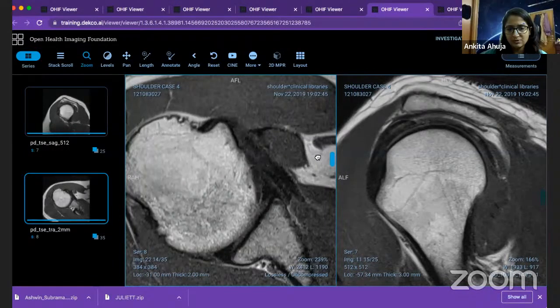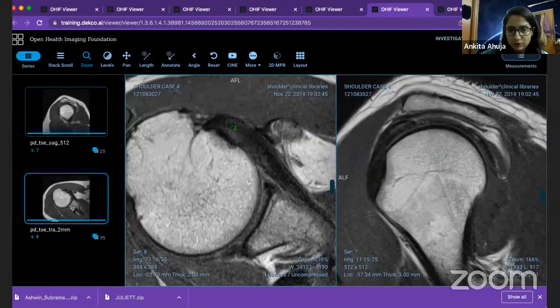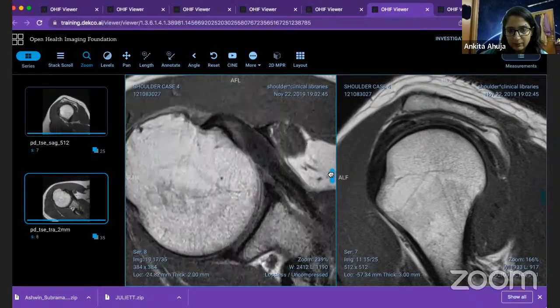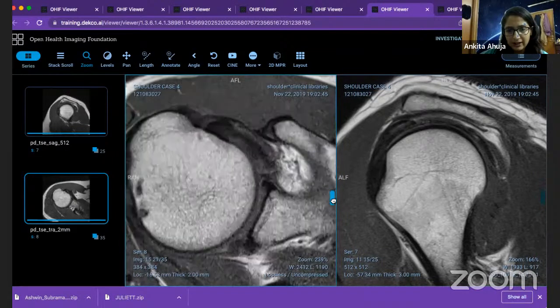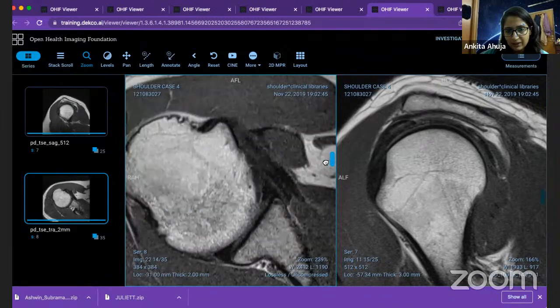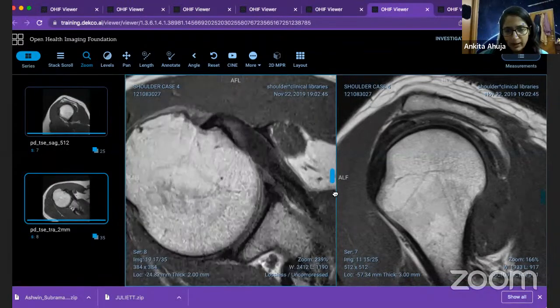Yes or no? Atrophy, subscapularis. Tendinosis. Yes, so if you see, this is your superior part. When I'm coming to this superior part, it looks a little thickened, and as you go inferior, it becomes like a simple tendon. That increased signal is not there. So there is only superior subscapularis mild tendinosis, but well picked up.